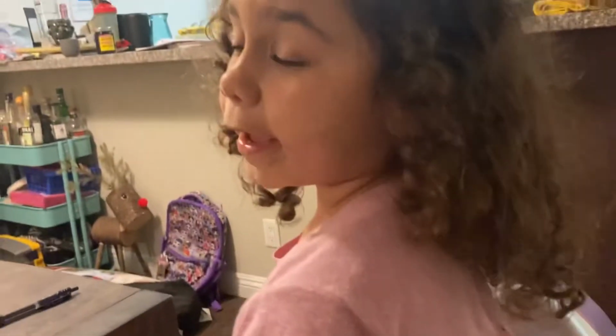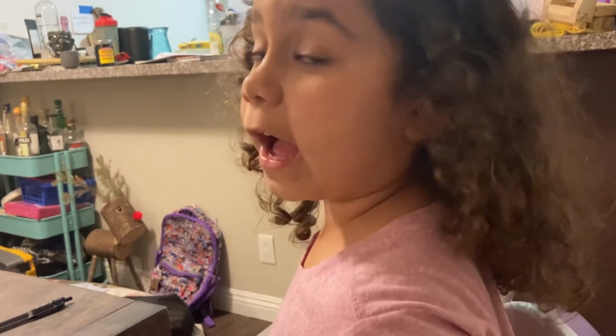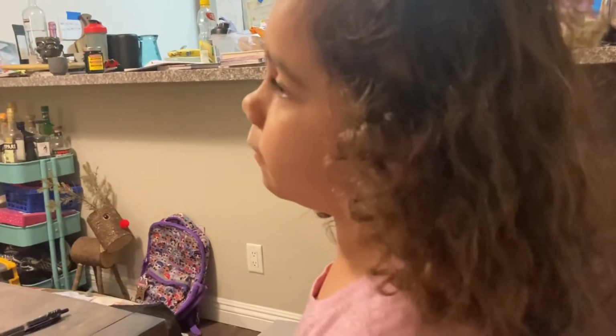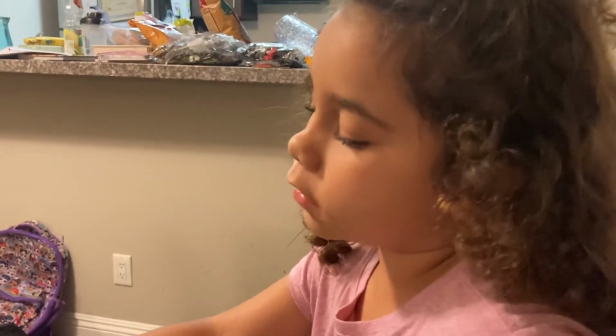Wait, I just have one safety warning for you guys. Make sure you do it in someplace like the butt, arm, or thigh. Other bony places won't work really well, and it could cause your child or anyone you're doing it to a little bit of pain. It's more effective if you inject in the fatty part. So Care-olina likes it in the love handle here.